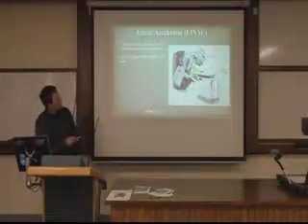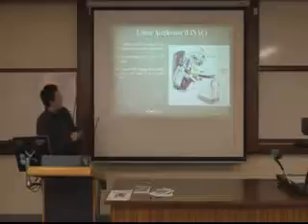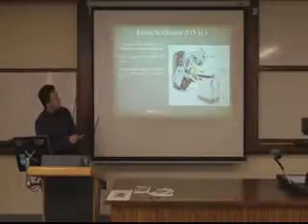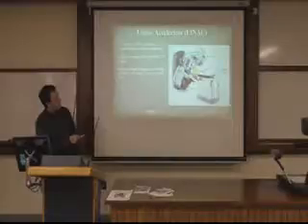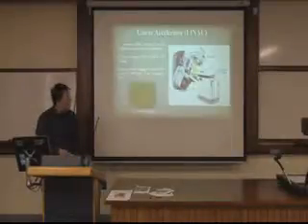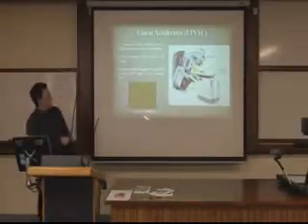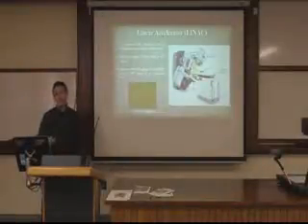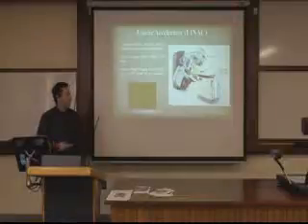So the linear accelerators that are used in radiotherapy, as you see here, have an orthogonal imaging setup. The yellow is the treatment beam, and the green is a kilovolt, so they're different energies. The treatment beam is megavolt energies, and the green beam is kilovolt energies. The kilovolt one is imaged by an onboard imager, and the megavolt one is imaged by an EPID, which is an electronic portal imaging device. Both constitute an array of pixels. Because we don't actually have access to the kilovolt images in the research I was doing, all my study is just using EPID images.